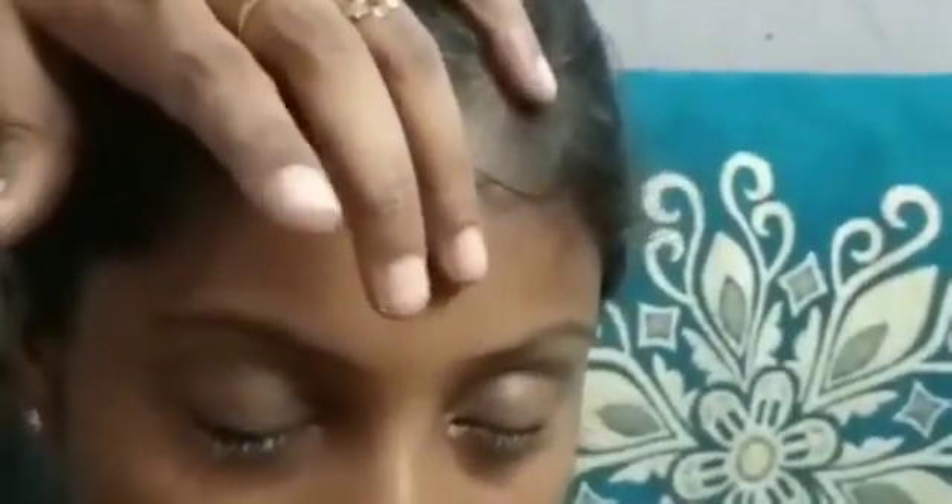Then hold the upper lid with the index finger of your left hand and the lower lid with the index finger of your right hand. Place the lens on the cornea and tell the patient to look right, left, up, and down until the lens is correctly placed on the eye. Then ask the patient to close their eyes for a few seconds.